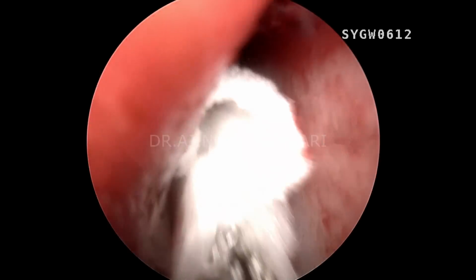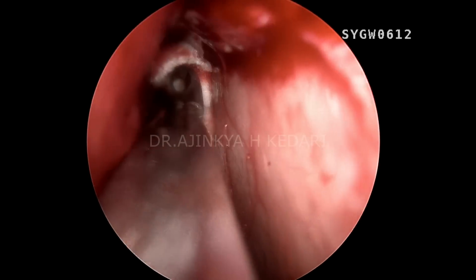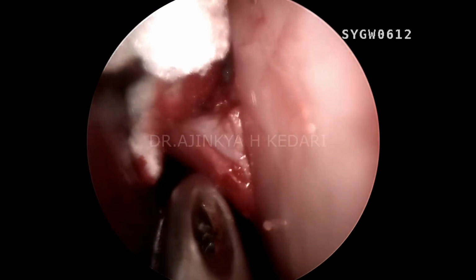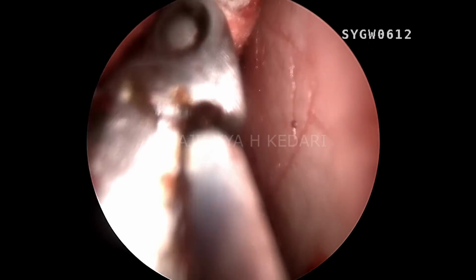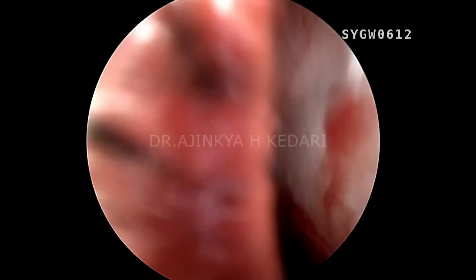That is additional support. That is the multiple layers of Abgel that I'm going to keep against that Hadad flap. Multiple Abgel pieces, moderate to large size. You can see the airway is free down there. That's the septum in midline. So at the end of the surgery, there will be no huge septectomy left, and the anatomy of the patient will be also well maintained.